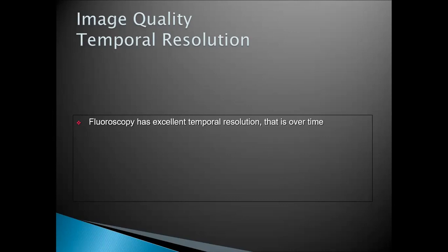If you have a video, or you are monitoring the introduction of a catheter in a vessel and you want to monitor the motion of that catheter at every point in time, you're monitoring it via a video monitor, the monitor inside the fluoroscopy room.